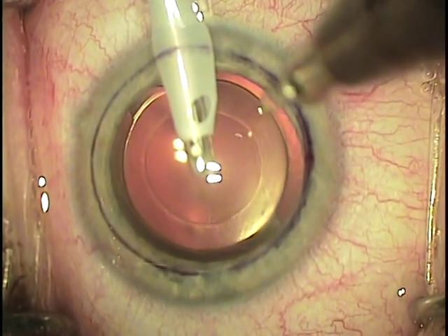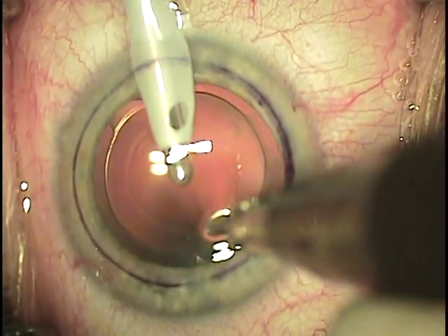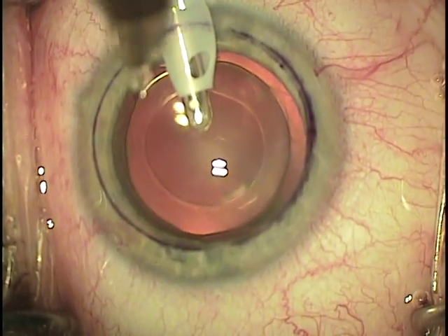Three full-thickness stab incisions are made in the mid-periphery in a circumferential manner with the same diamond blade used at the start of the case. They will be used at the end of the case to drain fluid from the interface.